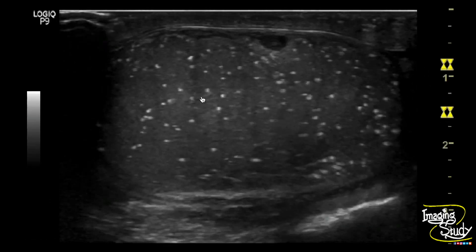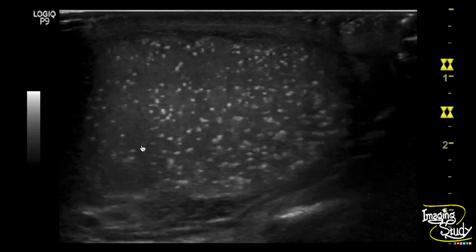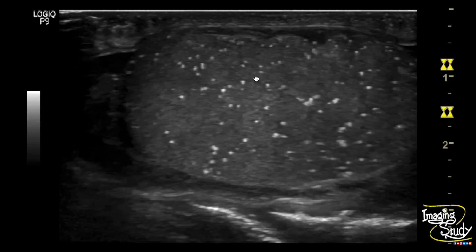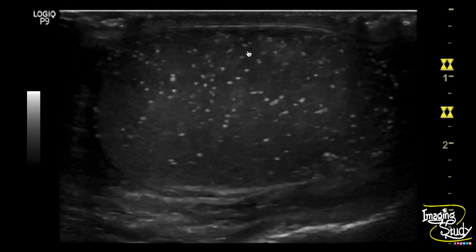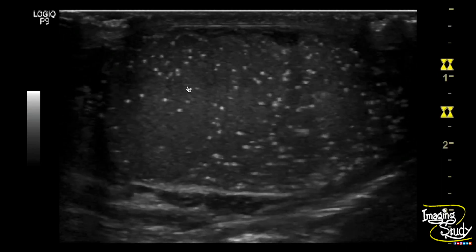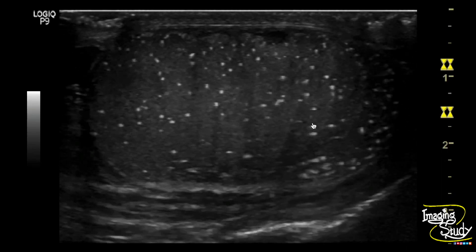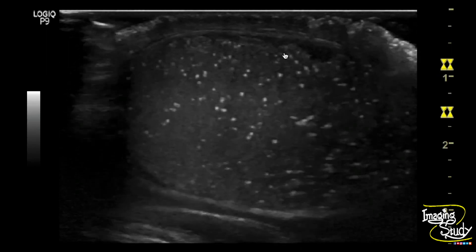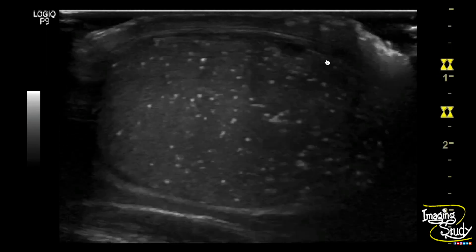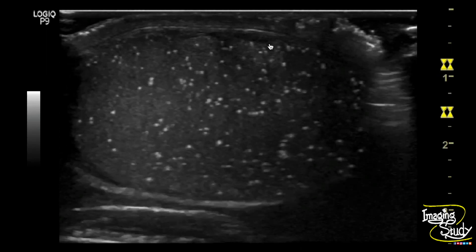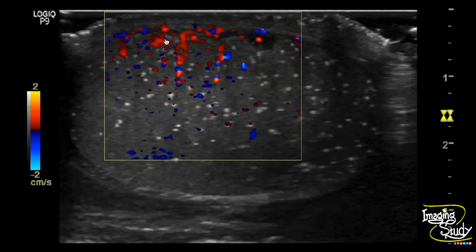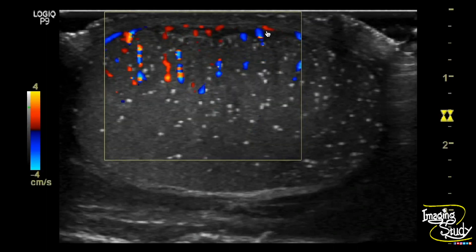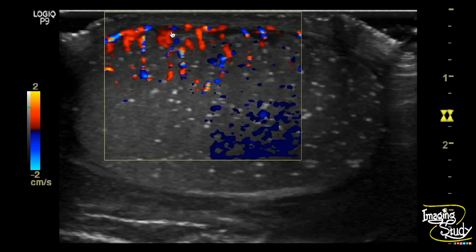Here's the left testis. It also shows hyperechoic tiny foci casting comet-tail artifacts. But you can see some hypoechoic stripes here, and if you look at the anterior border, you can see an irregularity of the tunica albuginea with some irregularity of the adjacent parenchyma and some hypo-to-anechoic collection.